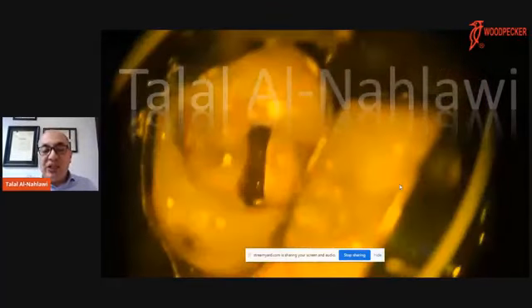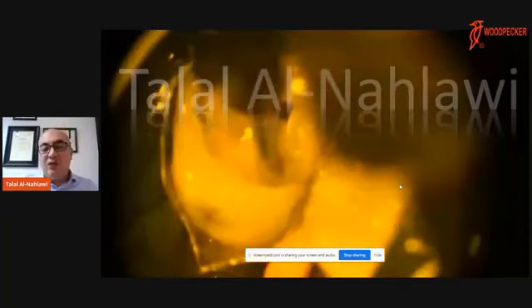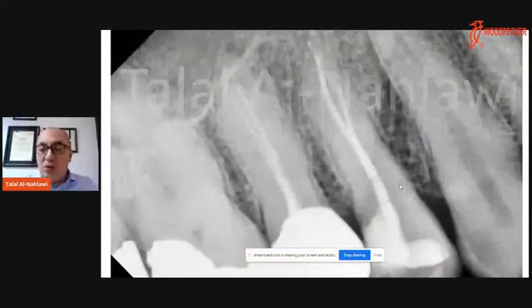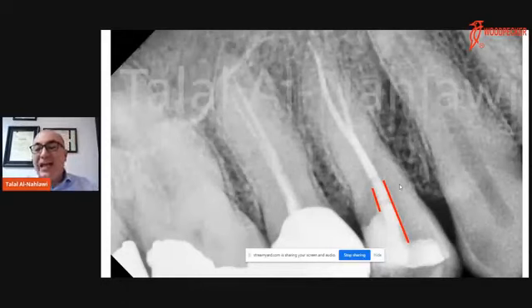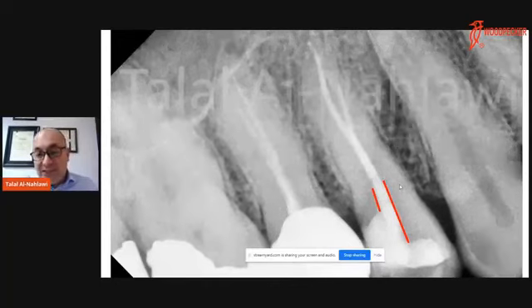And I can inject my smart dentine replacement or my flowables. Then I will continue doing the layering for my composite. And here you can see the post obturation, and you can see how precise, how conservative the access cavity was using the T3 without further removal from the pericervical dentine, without influencing the instrumentation. Because at the end of the day, if the access cavity is very small and it prevents proper instrumentation, it's contraindicated to keep it small. We have to enlarge it as much as needed, and keep it as small as practical.